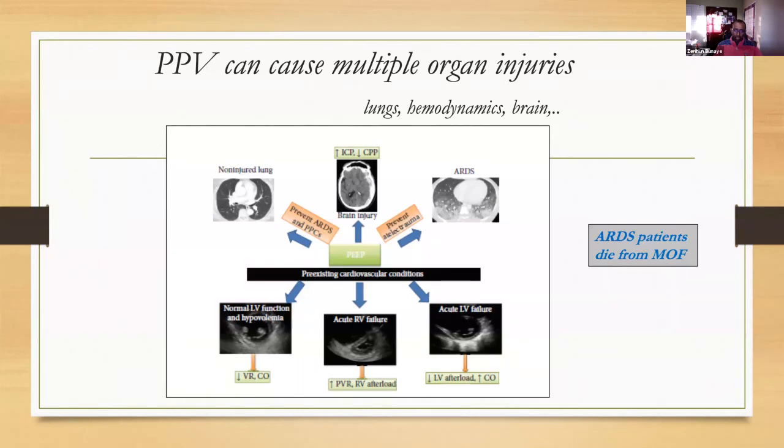So what the patient wants is that you give them safe ventilation with as little force as possible, so that they can live with the lung you saved for them in the long term. So the goal is to save the lung for the long term, not to correct numbers. So we should avoid any kind of over distension, and any kind of recurrent collapse.